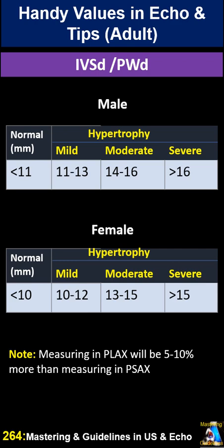Hi everyone. Here we have handy references for those important and common values in adult echocardiography. And for pediatric, I am going to prepare another clip. At the bottom of this clip, you will see the timeline.